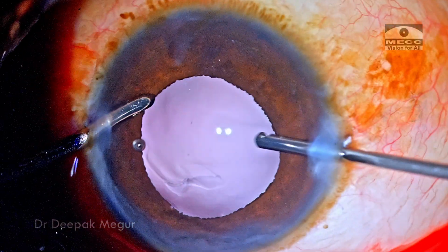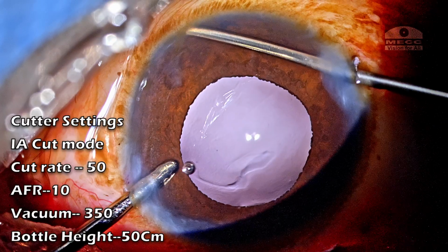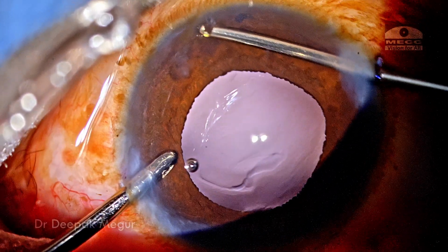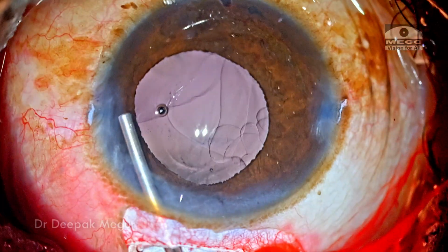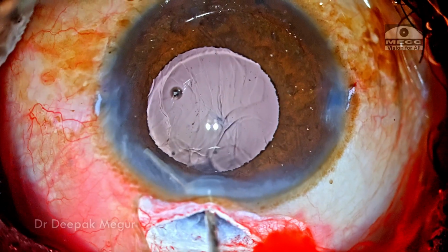Using the vitrector in IA cut mode, these are the settings which I use. I'm going to create the iridectomy in the inferior quadrant. Just 1 or 2 cuts are good enough to give a nice opening in the iris. The anterior chamber is filled with OVD. Time to implant the iris clip lens.